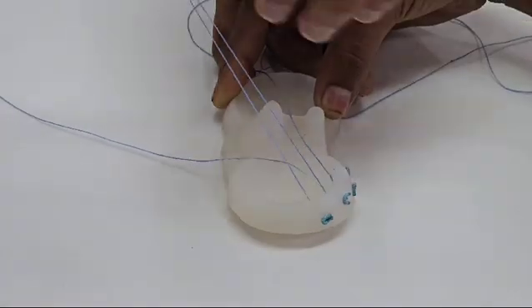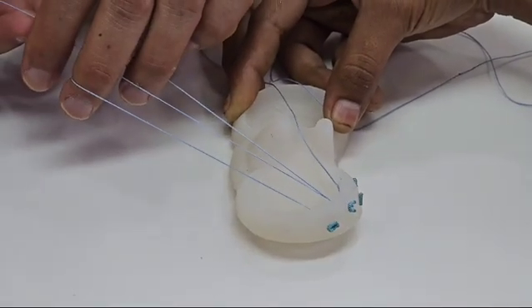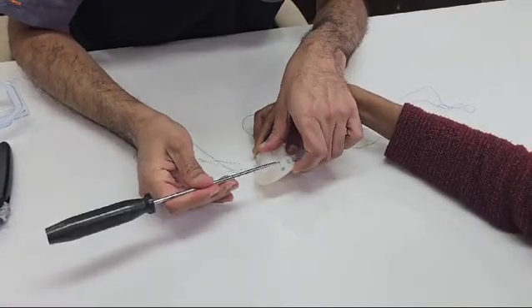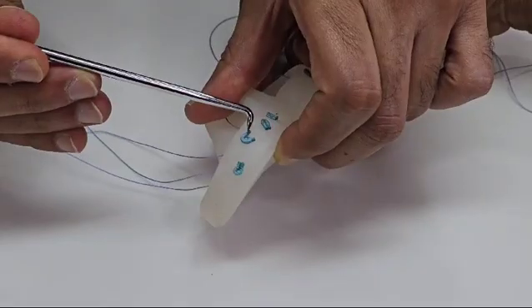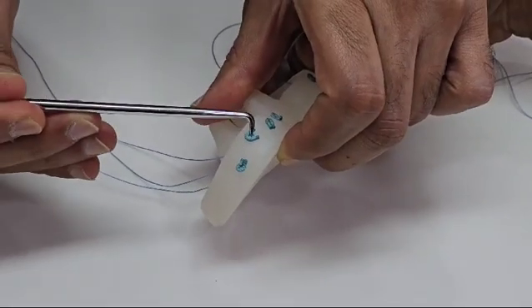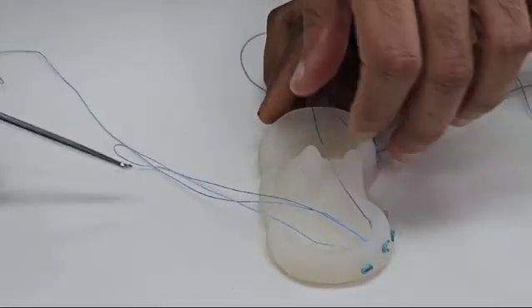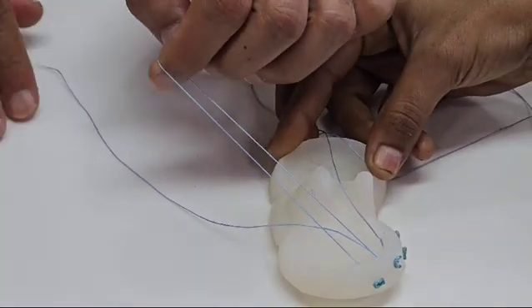This leads to a very solid fixation of the implant at the posterior aspect of the knee. The important thing here is the knot is also on the back side - you can see a small knot here. The knot in between the two implants is also on the back side of the knee, not on the front side. So what we do here now is we pull and keep this tension, and then we will pull the second knot.